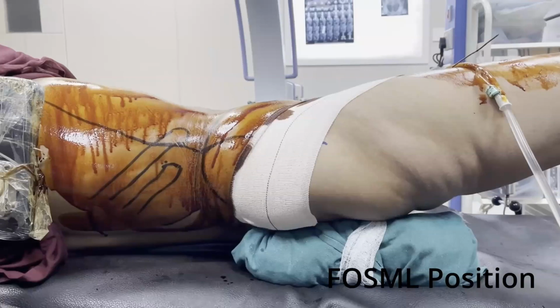We usually place the patient in FOSML position, that is flank oblique supine modified lithotomy position. We place a bolster below the buttocks on the operative side. Then we mark the posterior axillary line, and the 12th and 11th ribs are marked. Usually the 12th rib crosses the posterior axillary line, but here as the rib was small, it was not crossing the posterior axillary line.